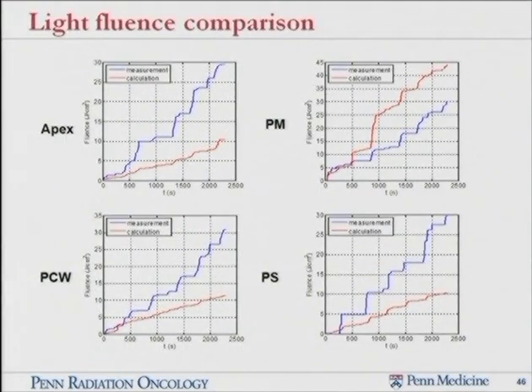And the difference, we currently are modeling as a constant fluence rate. So we know the scatter light in a perfect integrating sphere is the same everywhere. It doesn't matter where your light is calculating. And so we actually use a constant ratio, and over time that's a constant.